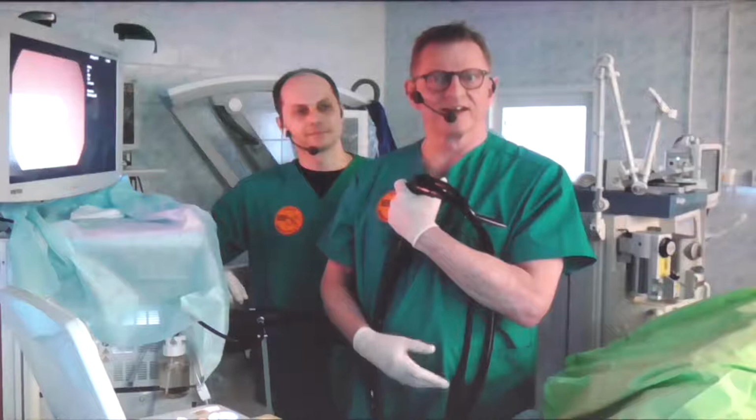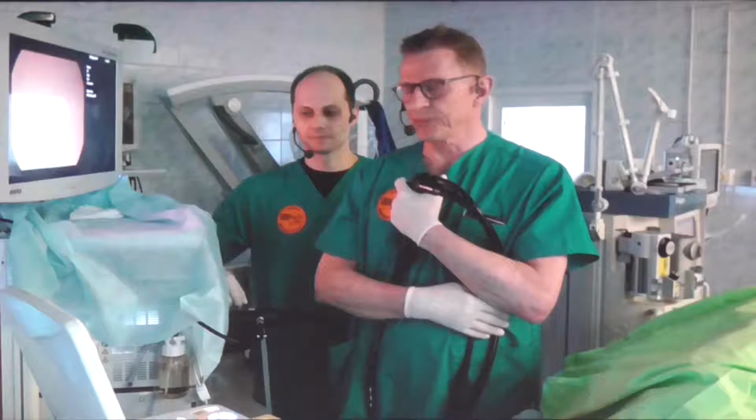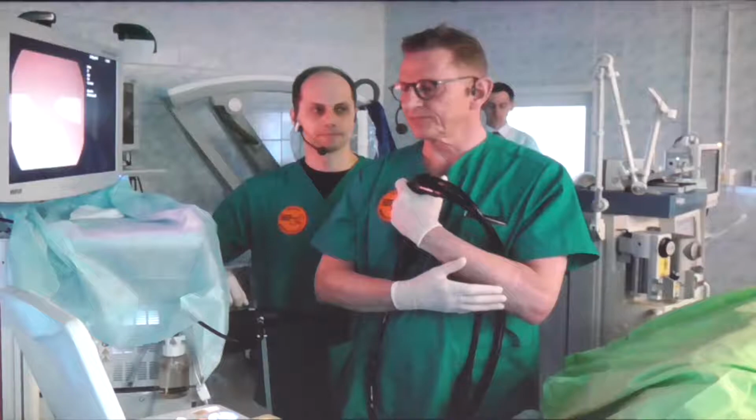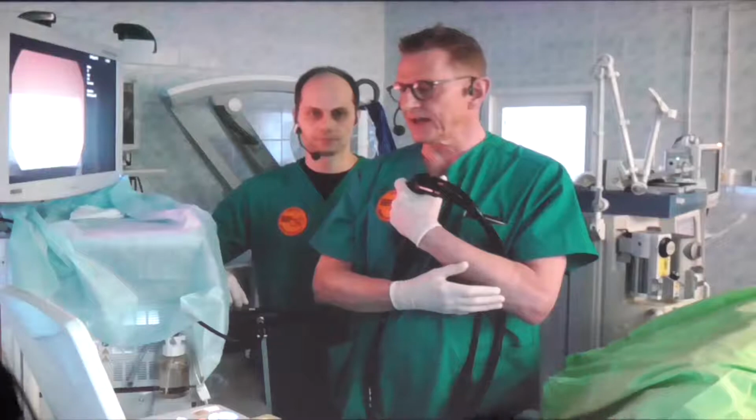Okay. Thank you for inviting me. It's an honor to be here and to do live demonstrations in a patient with a cystic lesion in the head of the pancreas. It's actually many years back that I started doing FNA, and I think this could be a case for FNA as well, but let's discuss that.